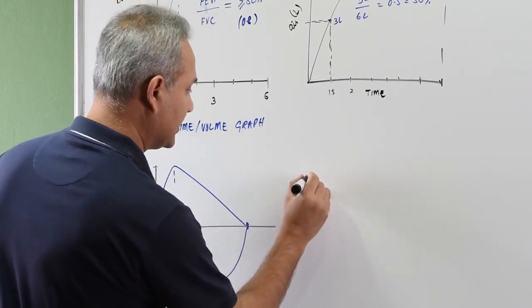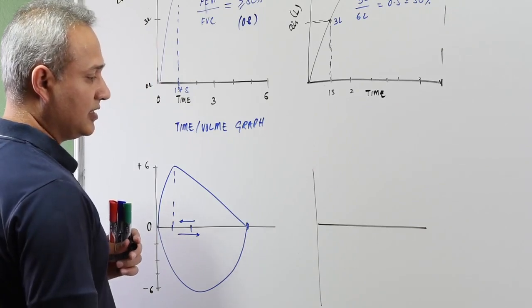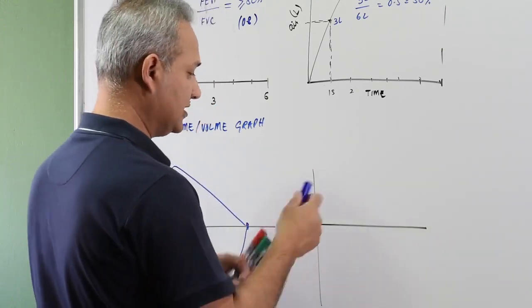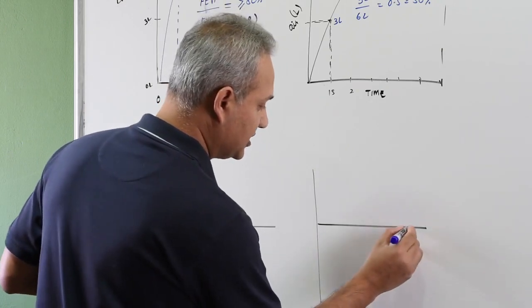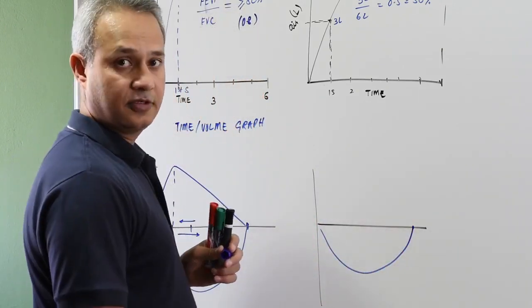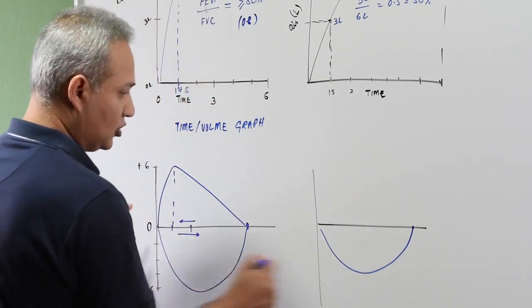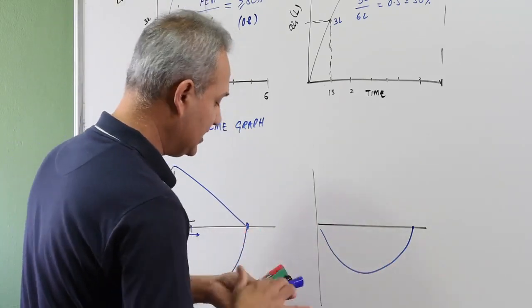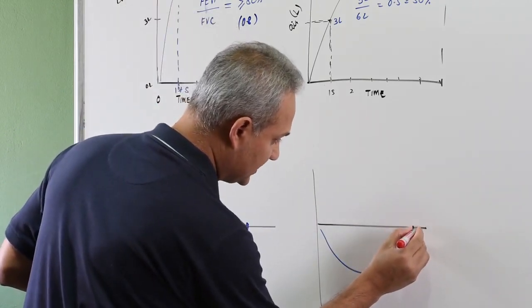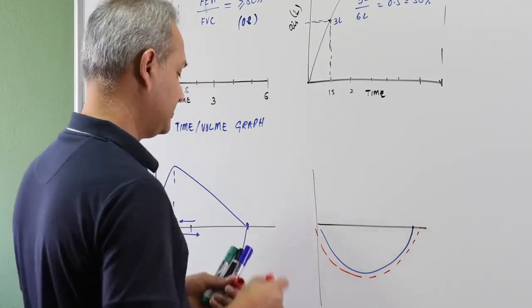So I'm going to plot this again here. So let's say you're in the respiratory unit. They show you this chart, and the chart looks like this. Patient is there, and patient inhaled, and inhalation looked like this. So good, normal inhalation. So let's say this is normal. Let's increase the volume a little bit. So patient's volumes are increased.